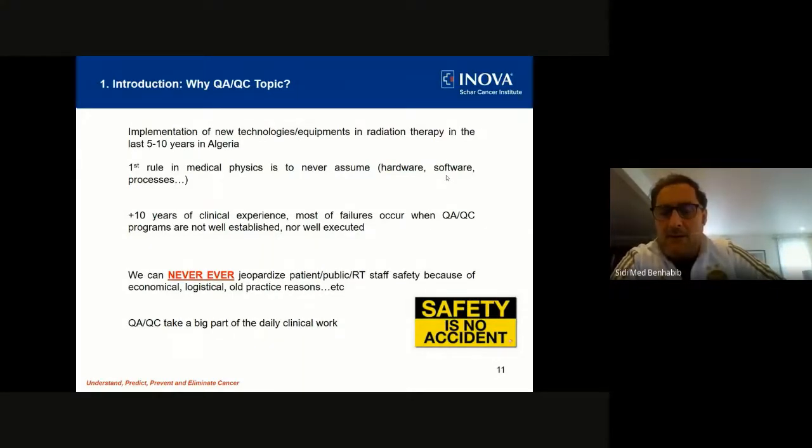I remember one time, I was in charge of brachy on that specific date, and I was called by the nurse. She had already set the patient on the table, and the physician was about ready to treat the patient. So the question to me was challenging. I was new in the field, a young medical physicist. And the question was, what should I do? Should I just proceed with treatment? And then I made the right call, which was to remove the patient from the table, do my QA, and make sure everything is running right before we treat the patient.